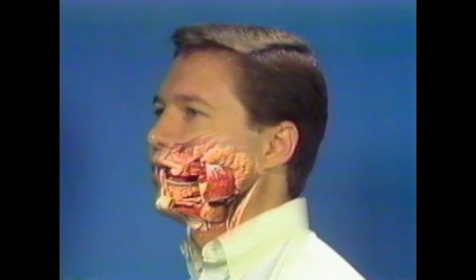An isometric contraction occurs when muscles contract and tension is developed, but the muscles do not shorten. The mandibular elevator muscles contract isometrically during maximum intercuspation, and the digastric muscles contract isometrically at maximum opening.